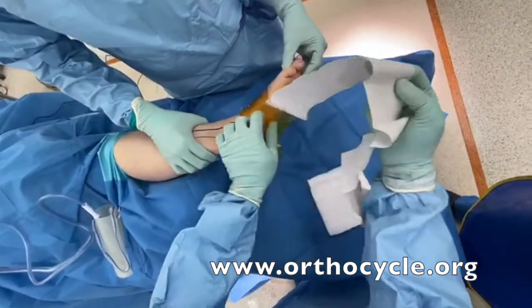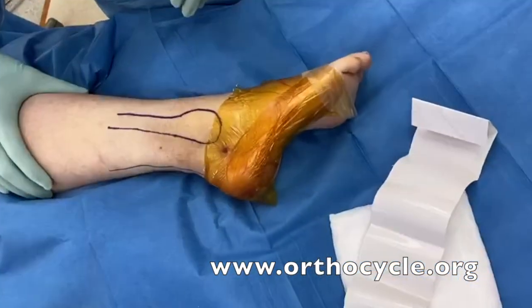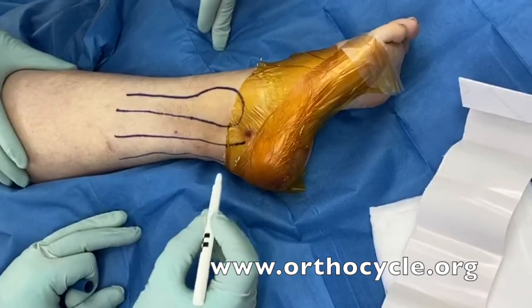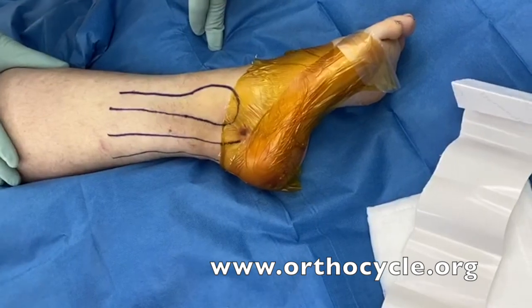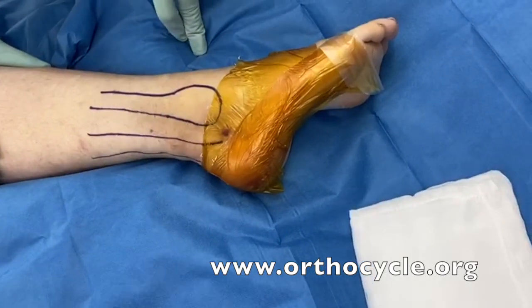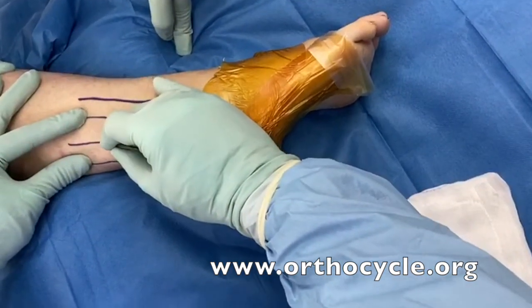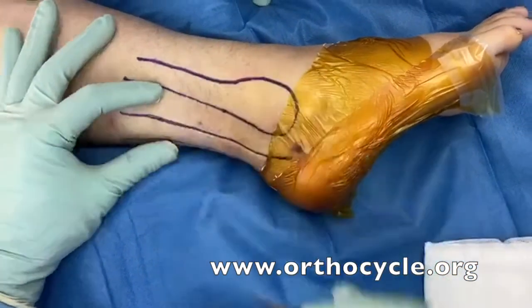The Denham pin was placed a little bit more superior than I would normally place it. I'd want it to be a little bit more inferior on the calcaneus, because where we are drawing now — halfway between the fibula and the Achilles tendon — is awfully close to where that hole is. I'd want it to be over the tuberosity, posterior to the axis of the ankle joint. So we're going to go ahead and make an incision, which is actually directly overlying where we think the sural nerve is.